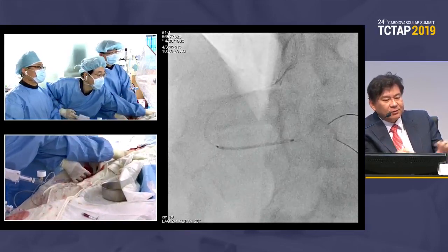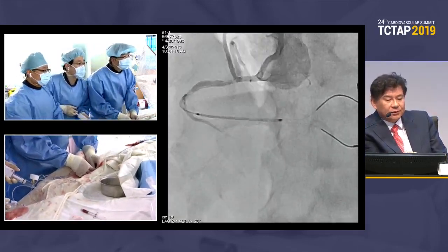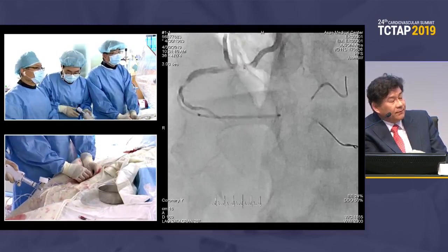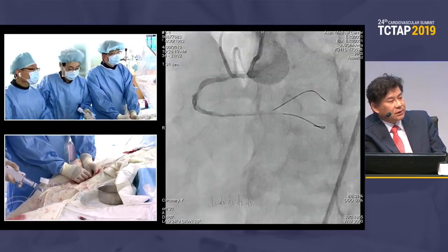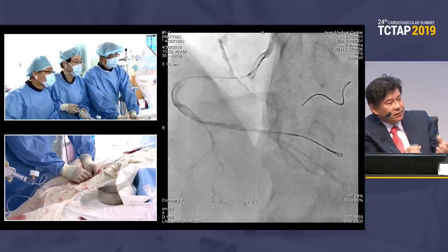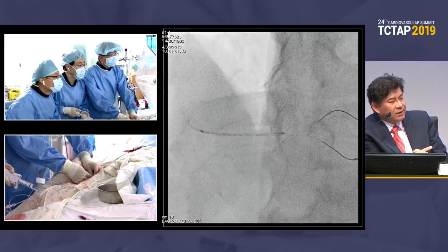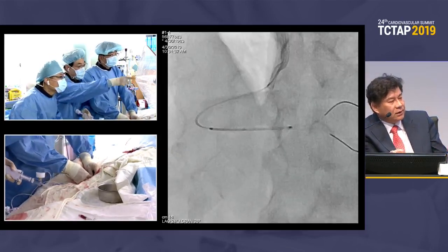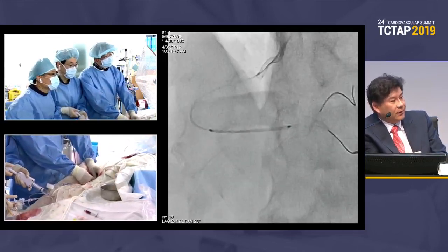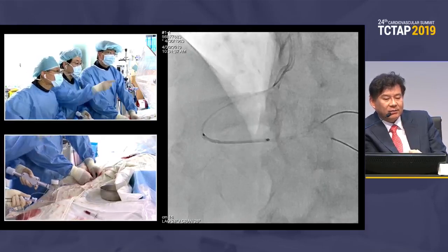However, diffuse negative remodeling or atrophic area is sometimes difficult to identify, even with the imaging. So in this case, I prefer to do the low pressure balloon, less than 4, maximally 6 atmospheres. Nicely expand. The plaque burden is clinically not prominent. If you cannot see the clear balloon margin, you have to inflate the balloon at higher pressure anyway. In that case, stenting will be needed. So low pressure balloon first, and then the culprit stenting. Then in many cases we see a good distal reference at the 6 month follow-up. So that is the low pressure balloon technique. Personally, I prefer shorter stenting rather than the longer entire metal jacket.